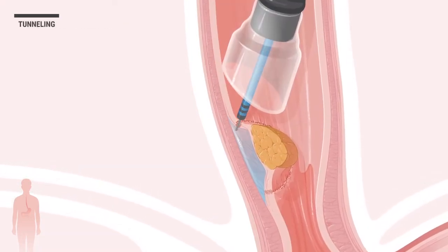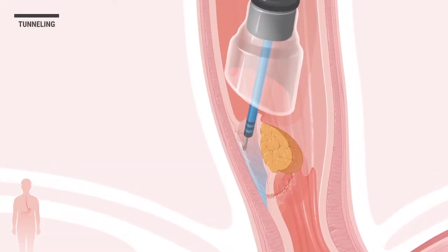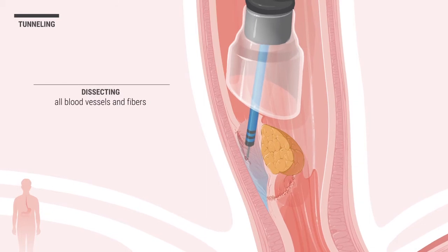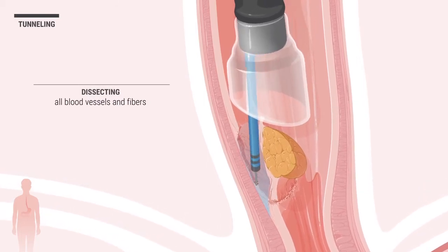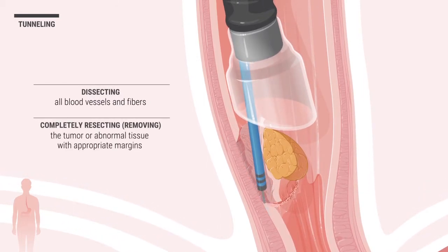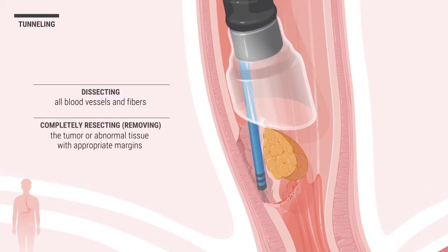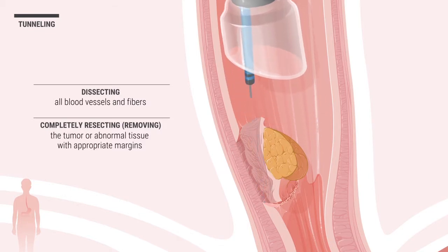After, the knife is used to tunnel under the abnormal tissue, dissecting all blood vessels and fibers and completely resecting or removing the tumor or abnormal tissue with appropriate margins.